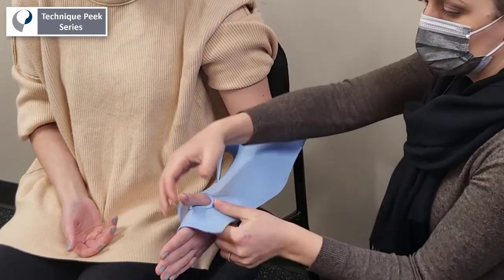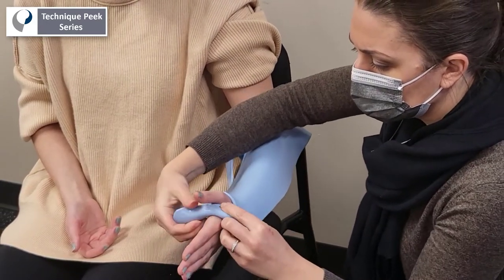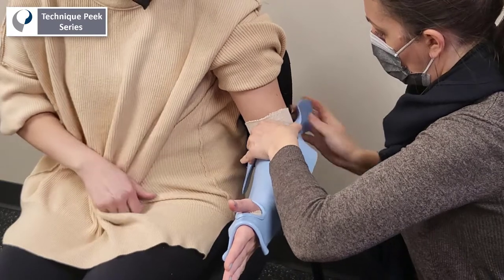Next, roll down the distal edge of the material to clear the distal palm or crease. This will allow unrestricted MCP joint range of motion. You can now move proximally to roll the edge of the elbow crease away from the patient.